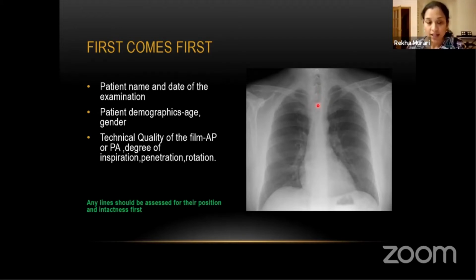Even after looking at all these, before starting an approach to the chest x-ray, especially in ITU patients, I always try to look at any lines and also assess their position and intactness before we start the approach. Otherwise, there's a tendency to miss them in the end.